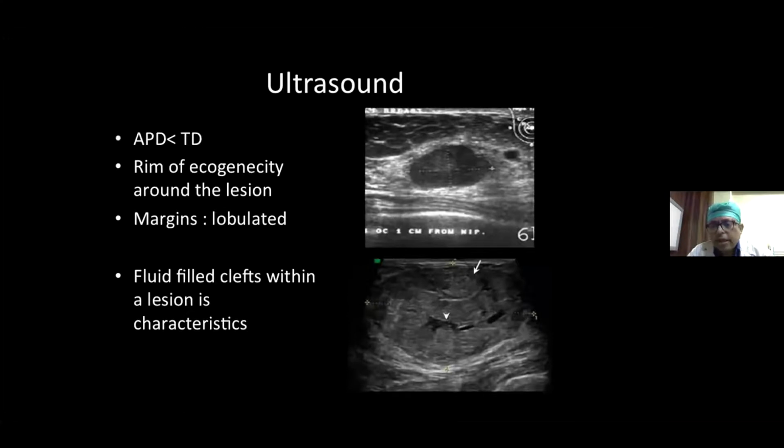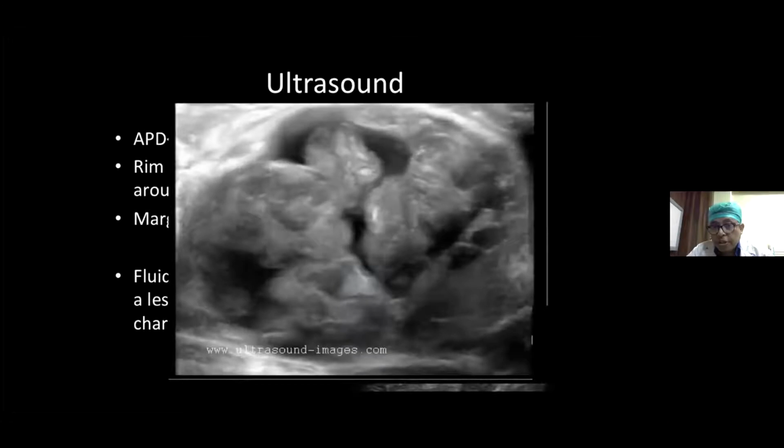And this is again a classical example of a cleft. Now, if you have an enlarged picture, you can have these multiple clefts appearing within the lesion, yet the lesion is quite uniform. This is the hallmark of a phylloid tumor, but you cannot go beyond that to tell whether it's a malignant phylloids or a benign phylloids. You need a core biopsy to confirm.